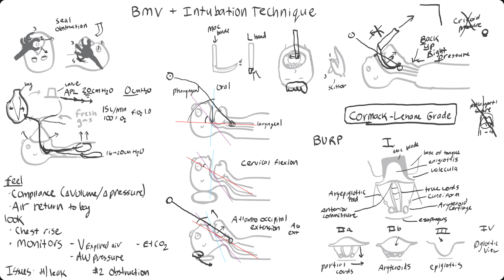So now you can put your thumb on the lower molars and push the lower jaw away, and your third finger on the upper molars and push those teeth away, and you should be able to spread the mouth open by this technique. Now, disadvantage to this, obviously you're putting your gloved hand into the patient's mouth, so now that's not clean, and you're also kind of taking up a little bit of your room on the right side of the mouth, so it takes a little bit of practice to do this technique properly.